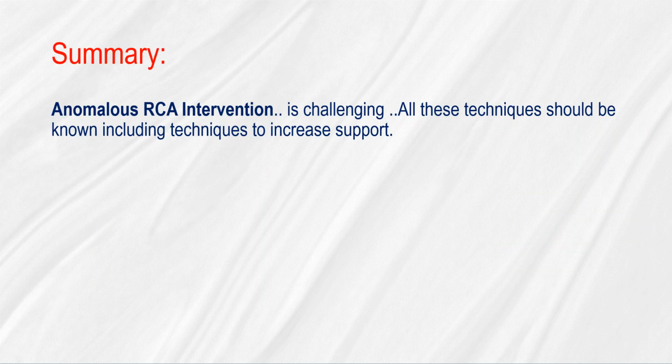Summary: anomalous RCA intervention is challenging. All these techniques should be known, including techniques to increase support.